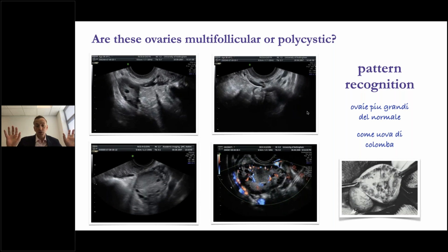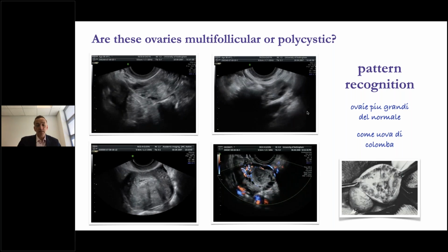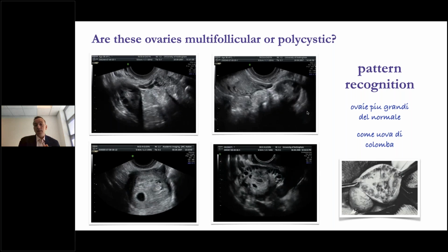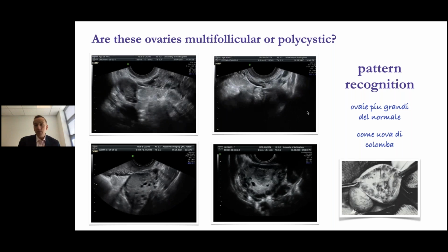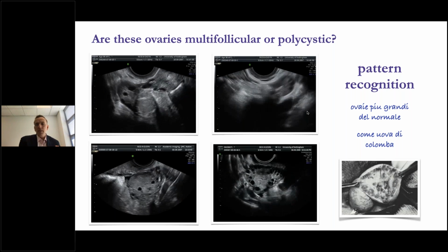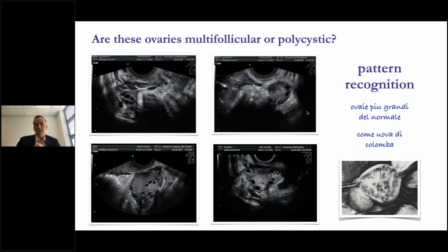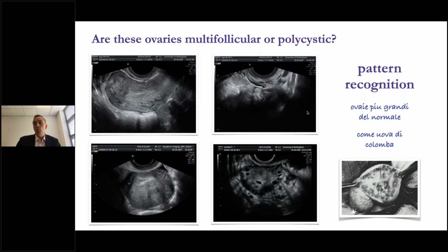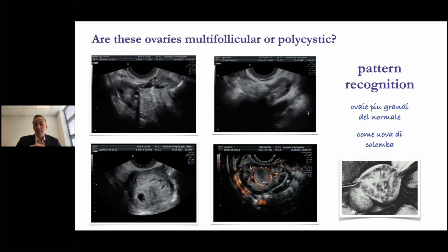This is no medication, no clomiphene, no letrozole. And in the bottom left image, you'll notice there's actually a little fetus there. So we have people with profound PCOS who are oligomenorrheic, who've got hundreds of follicles, AMHs of 100 plus, who still ovulate, who still conceive, who don't miscarry. And yet we've got patients with lower numbers who respond very strangely to IVF, don't respond, then over-respond, and produce many poor quality eggs and many poor embryos as a result. So much more work needs to be done here. Again, it is really a black box of science that we need to tap into.